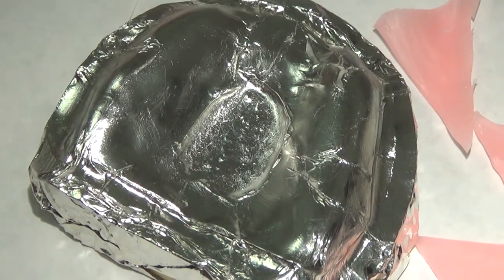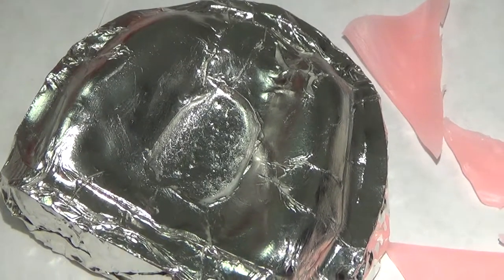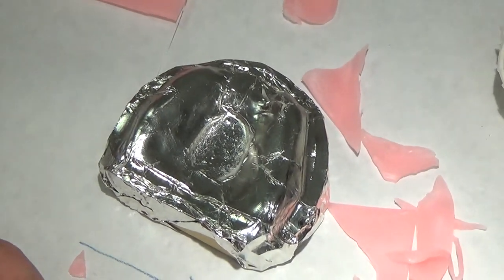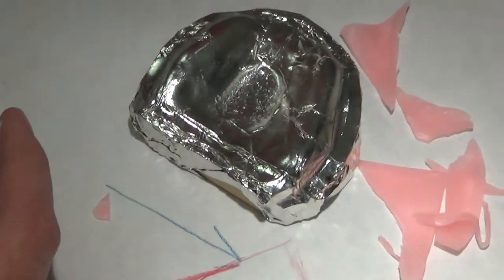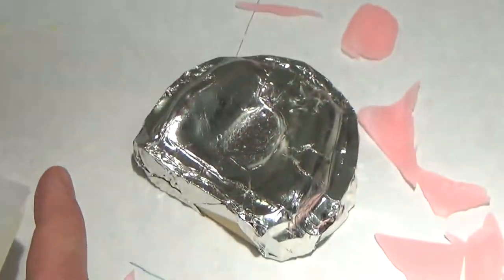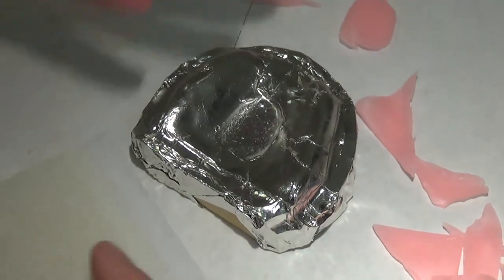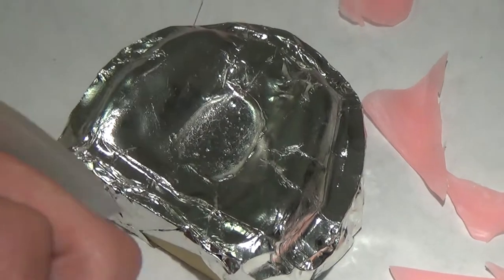So you can see the difference in this type of tray versus the one that we did last week. Some of you have watched the demo. I've only used a half a piece of base plate wax and one piece of tinfoil almost completely covers my cast. I don't have tall ridges. I don't have teeth. I don't have a deep palate. So my materials go a whole lot further.